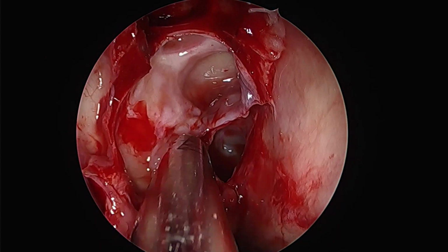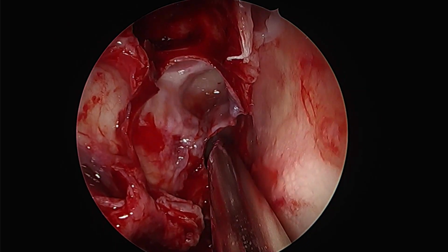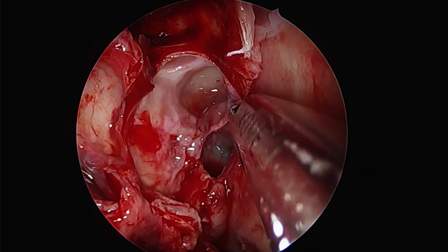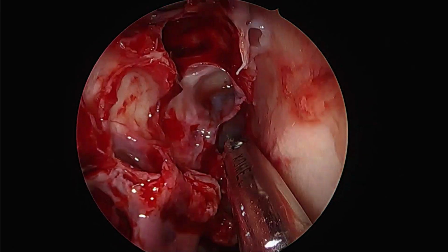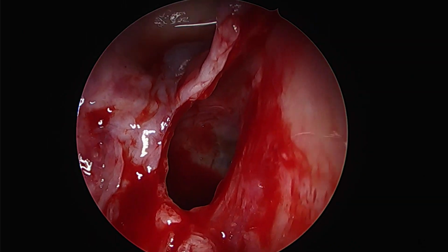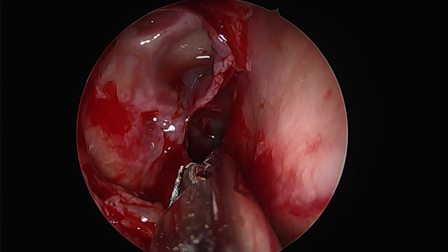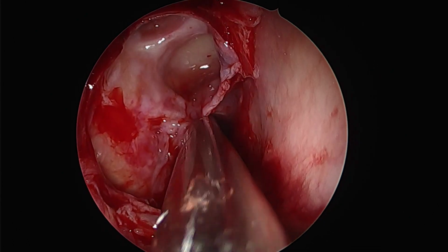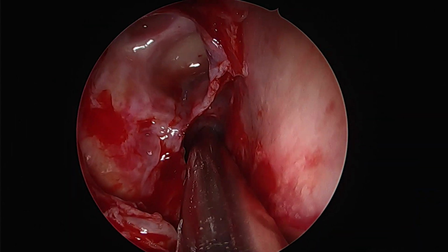This is the sphenoid sinus on this side. The posterior ethmoidal cavity is open. One can see the ridges that define the location approximately of the posterior ethmoidal artery. We can see here the CSF leaking from this small meningocele. This is the sphenoid sinus.